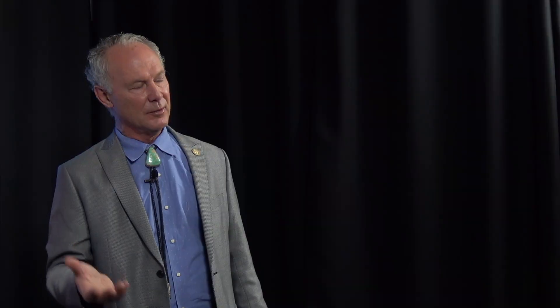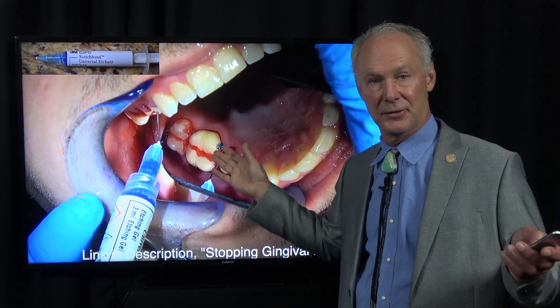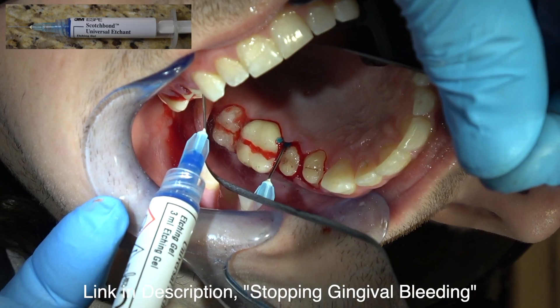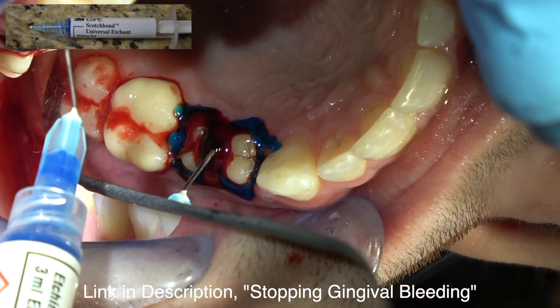I discovered it by accident when I was placing veneers or doing composites and the etch got on the gingival tissue. After leaving it there for 45 seconds to a minute, the bleeding stopped. So just squirt it on there and leave it. You may have to do it a couple of times if it's really bleeding.